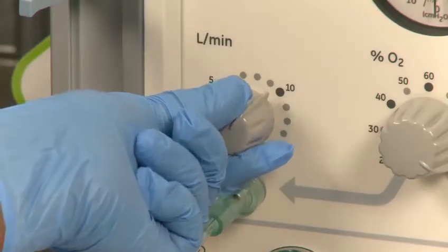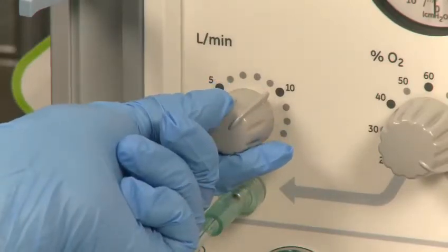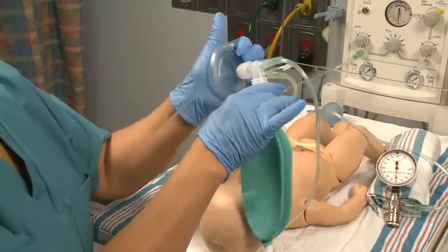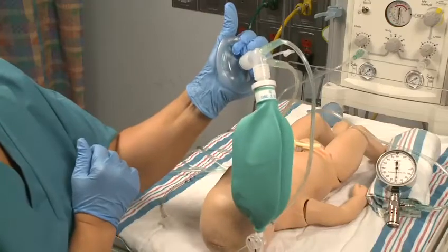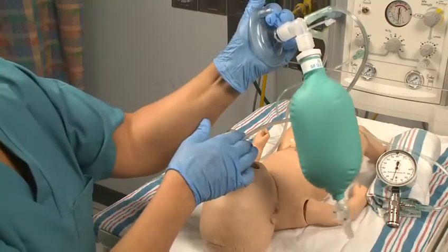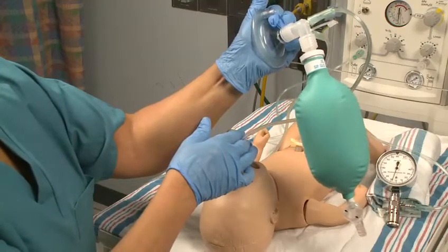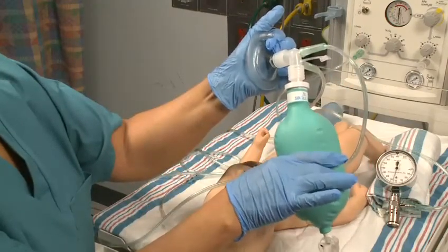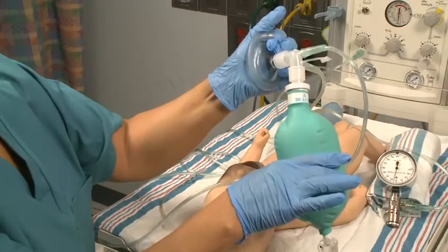Notice what happens when the gas source is turned to 10 liters per minute. The bag inflates only when a gas source is forced into the bag and the opening of the bag is sealed, as when the mask is placed tightly against the newborn's face or against your palm to check the function of the bag prior to a birth. Give a few test breaths to ensure that the bag fills with no evidence of a leak or a tear.